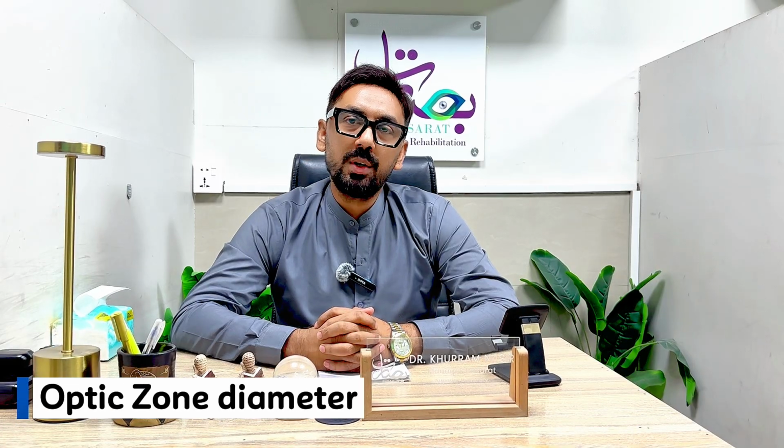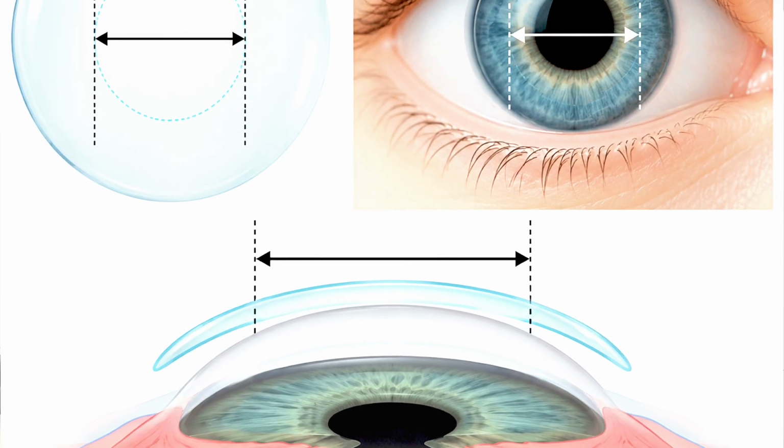And the next parameter is called the OZD, the optic zone diameter, right? And what is the optic zone diameter? It is the diameter of the central optical portion of the lens, right? And this optic zone diameter is very important while we are dealing with the RGP lenses, right? It can affect the fluorescein pattern, and it affects the vision as well.